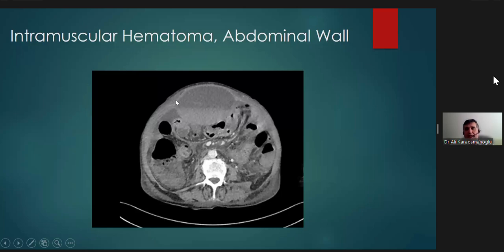When you see this level, serum sediment level or fluid level, it's mostly more predictable, I should say, for a subacute phenomenon, not an acute phenomenon. That's not always the case. But when you see this serum sediment level, always consider a subacute process, not an active one.